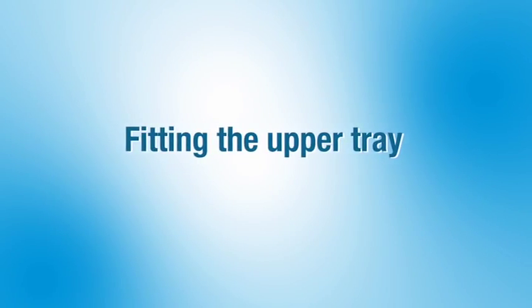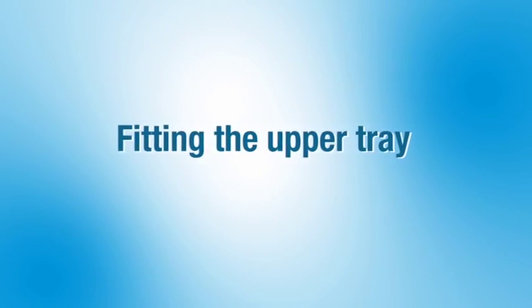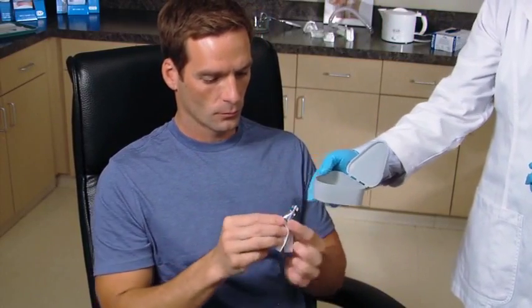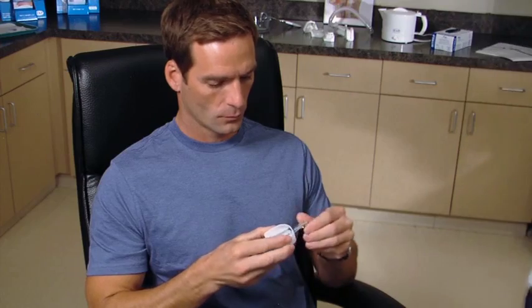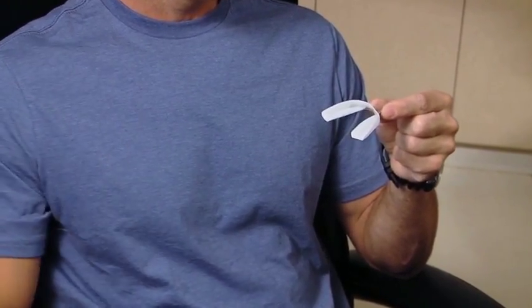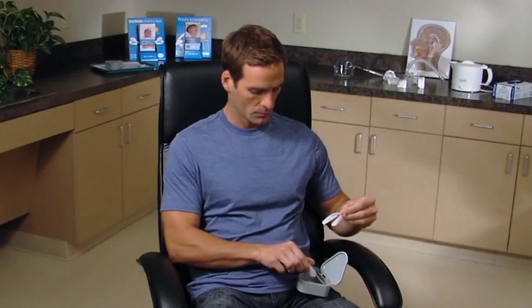Fitting the upper tray. Remove the myTAP from the case. Disengage the upper and lower trays by unscrewing the adjustment dial and separating the trays. Set aside the adjustment dial in the lower tray.